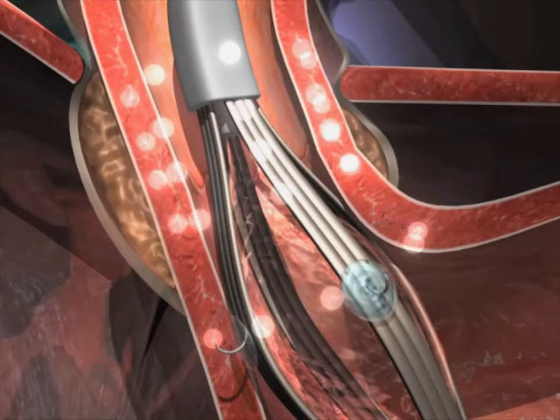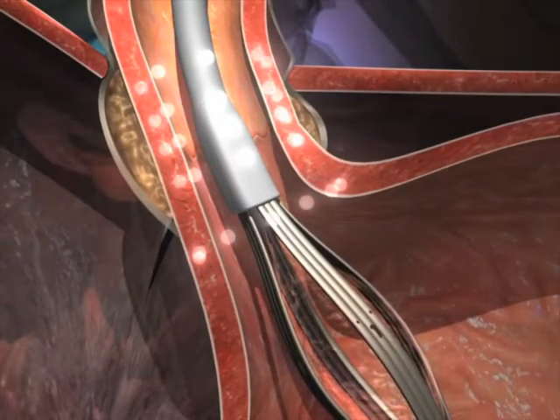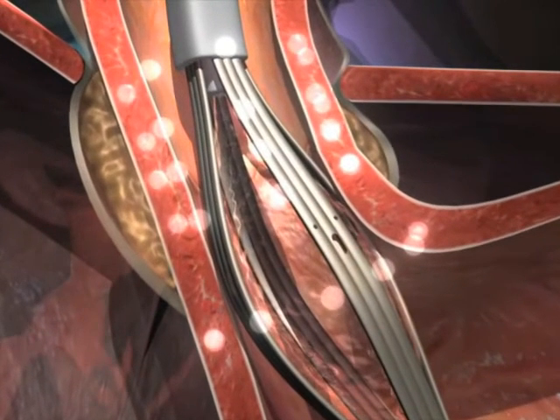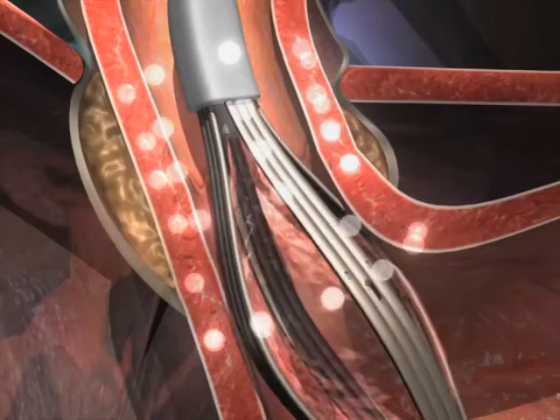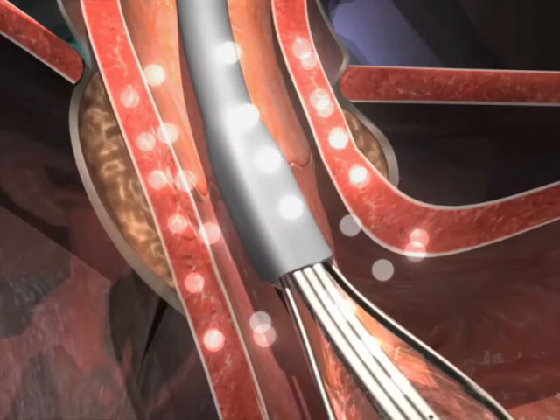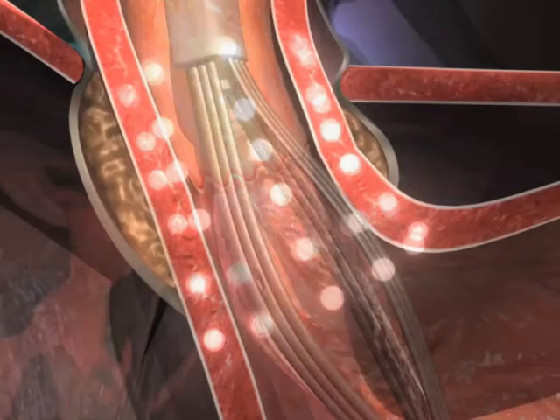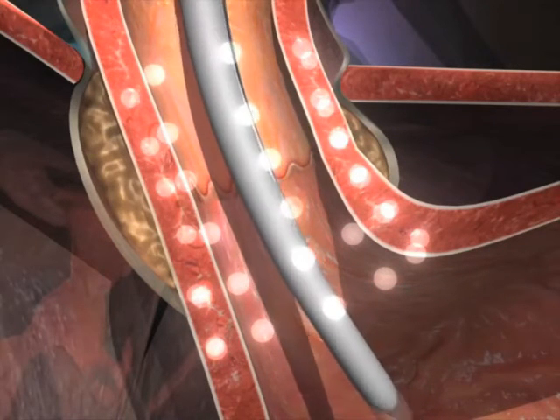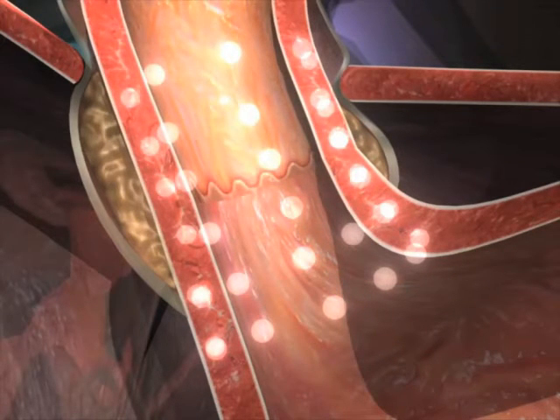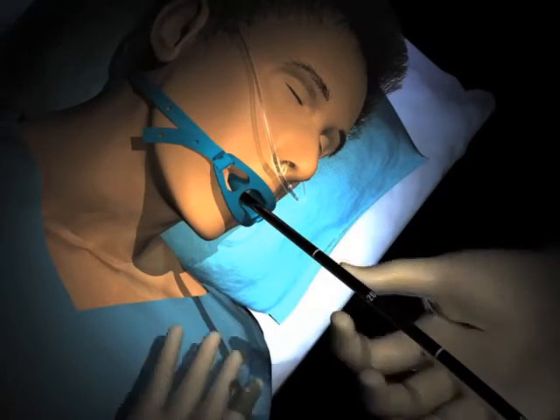52. For treatment level 6, retract the needles and advance the catheter again into the fundus of the stomach. Deflate the balloon to 22 milliliters. Pull the catheter back slowly until resistance is felt — this should place the needles above treatment level 5. At the completion of the first treatment cycle at this level in the gastric cardia, retract the needles and advance the catheter into the fundus of the stomach. Rotate 30 degrees to the right, pull the catheter back to the identical treatment level, extend the needles, and repeat the treatment. Then repeat this process at 30 degrees to the left of the initial treatment. Following completion of 6 levels of treatment, the balloon is deflated and the catheter is removed. An endoscopic inspection of the treatment area should confirm safe delivery and completion of strata therapy. Disconnect the strata catheter and dispose of the device.